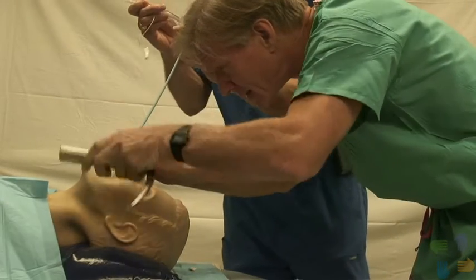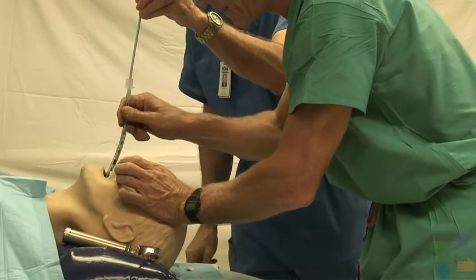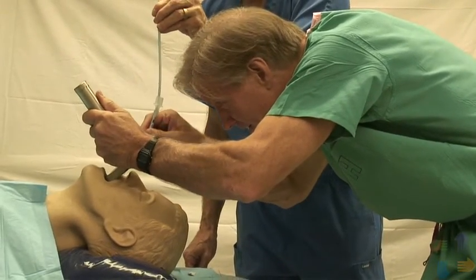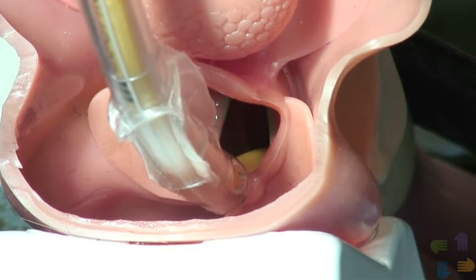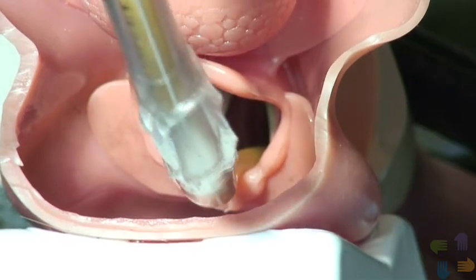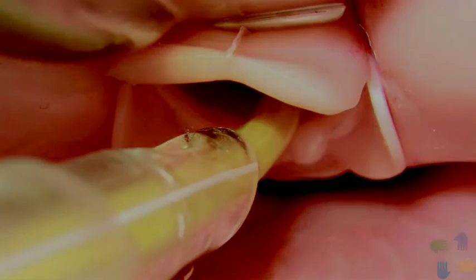There is a tendency to remove the laryngoscope after the bougie is placed. This should be avoided because, in the absence of the blade, the hypopharyngeal soft tissue tends to push the bougie and the endotracheal tube posteriorly and results in the tube catching on the arytenoids. The scope must then be reinserted, the endotracheal tube pulled back slightly and rotated counterclockwise as it is readvanced into the larynx. If resistance is encountered when passing the endotracheal tube through the laryngeal inlet, it should be pulled back 2 centimeters, rotated counterclockwise 90 degrees, and readvanced. This maneuver orients the bevel of the endotracheal tube posteriorly and allows it to easily slide over the arytenoids.